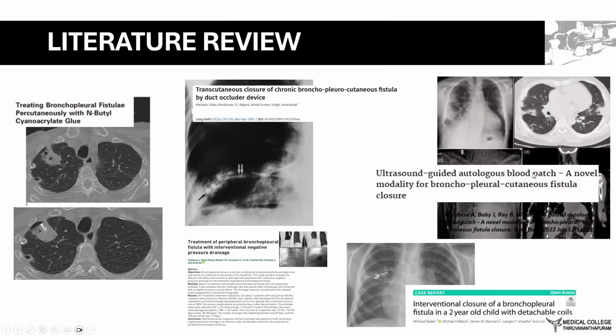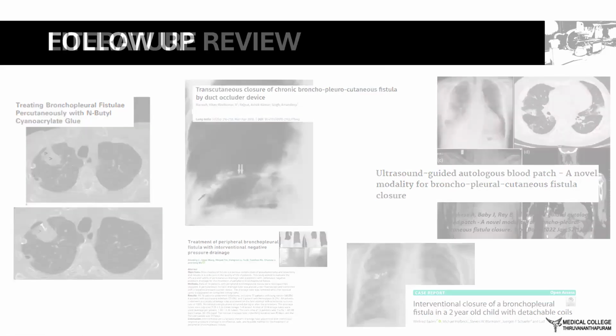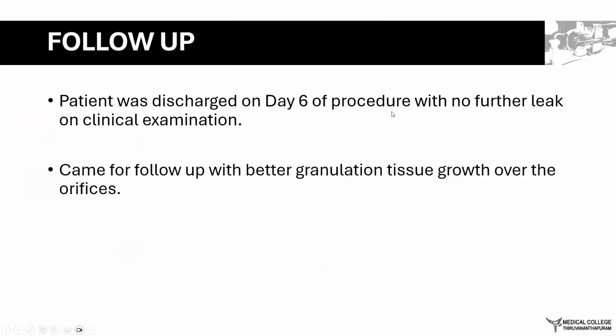And also this procedure of ultrasound guided autologous blood instillation using a Chiba needle is described. Incidentally, this is described or done by one of our Chitra alumni, Brijesh sir, who is presently working in Aster, Kochi. So this patient was discharged with no further leaks.